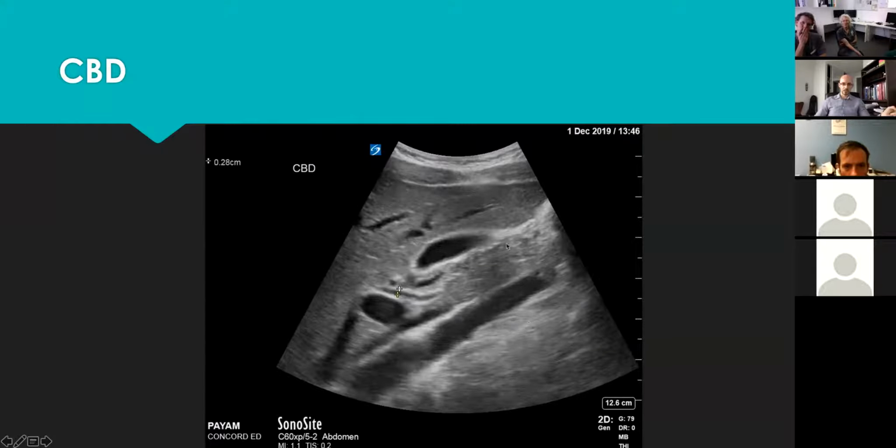Okay. So this is a glimpse of the gallbladder. We are cutting the gallbladder short, as in just cutting it not in a proper axis. And you can see the hepatic veins in it. You can see the CBD there. This vessel there most likely is the IVC. Technically, it's very unlikely it can be the aorta, but if you put the color Doppler on, depending on the color Doppler pattern, most likely it's the IVC. Sure, thanks. No worries. And this is just an edge shadow of the side of the portal vein.